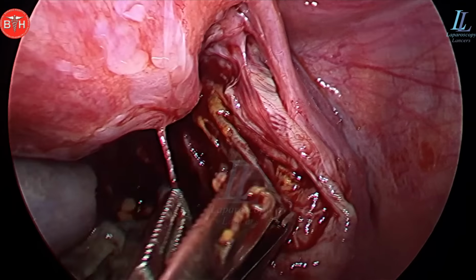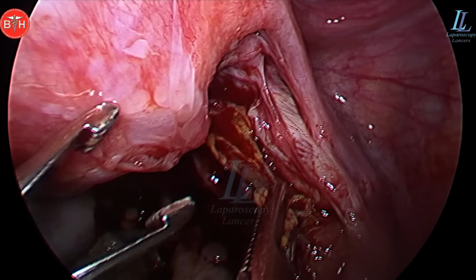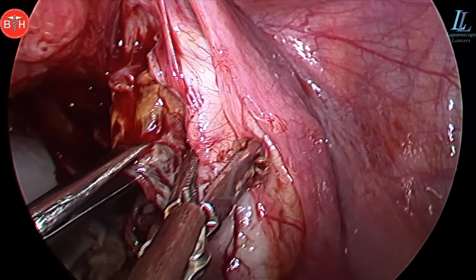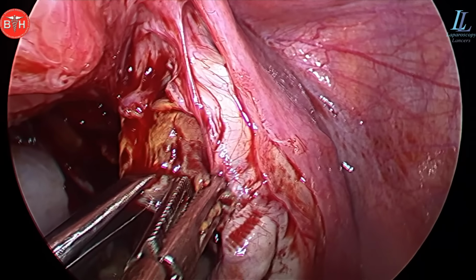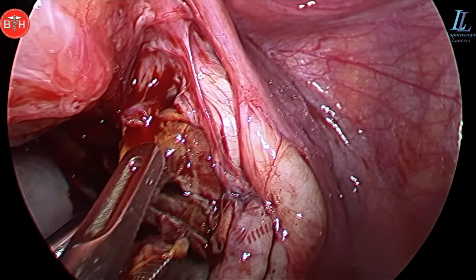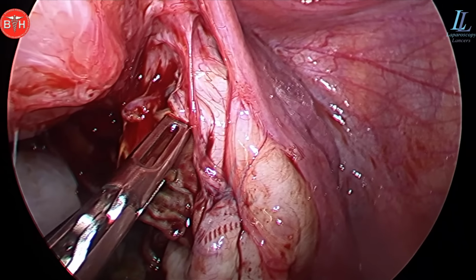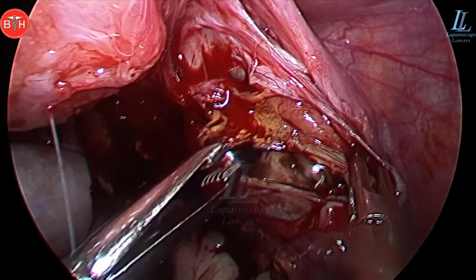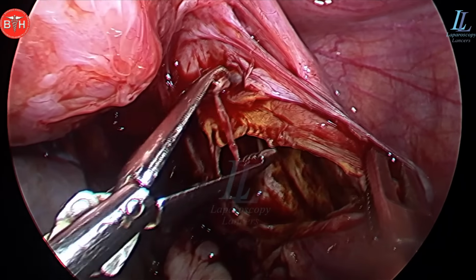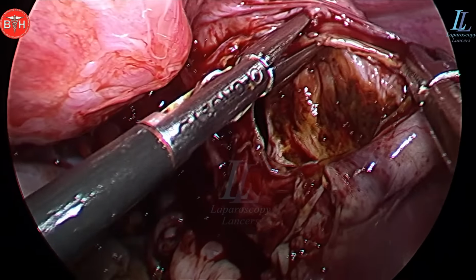So be patient, go step by step, no hurry, and be watchful. And if at all you are in doubt, please ask your camera surgeon or the anesthetist that if they see anything else. So respect their opinions also and watch. And there you can see I found one more chocolate cyst there, and now this also needs excision.